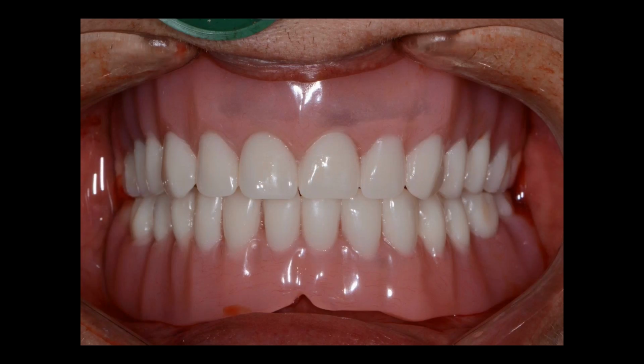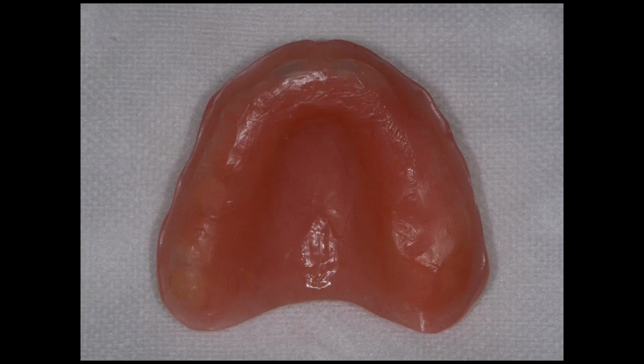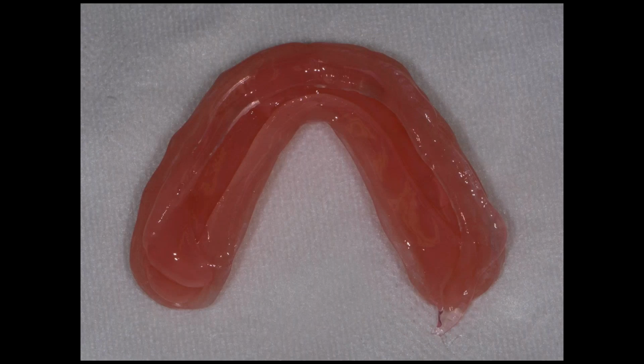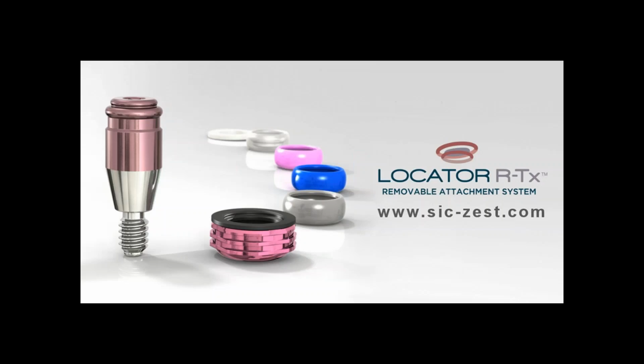Once the implants were placed, we confirmed that the dentures fit and articulated well, so we soft relined the upper and lower denture. As you can see, in the lower, we're relieving the areas of where the healing caps or the locators will be. And then we soft reline both, allow this to heal. In this particular case, we did allow it to heal for longer, because a couple of the areas were not as stable as we would prefer, so we didn't want to risk it.